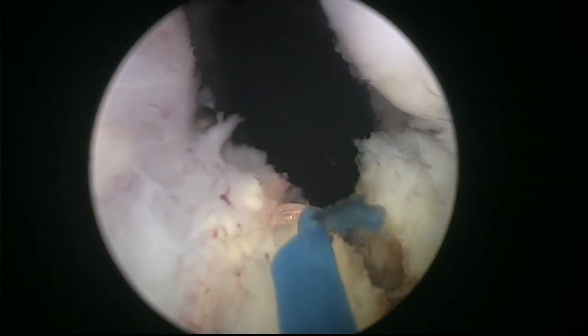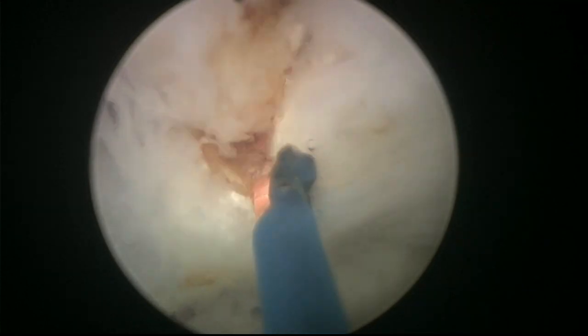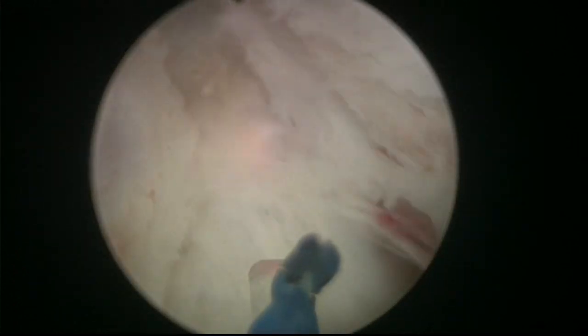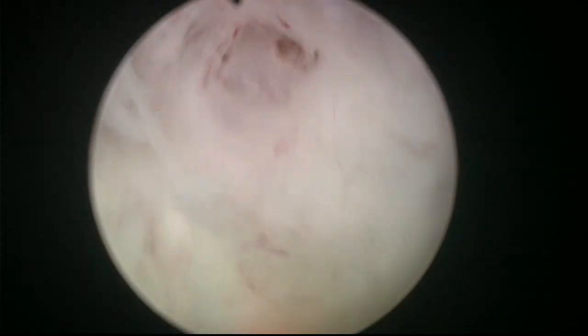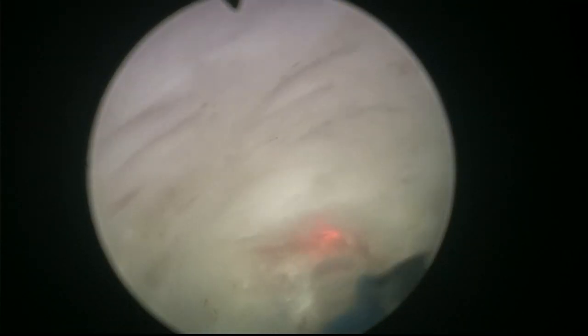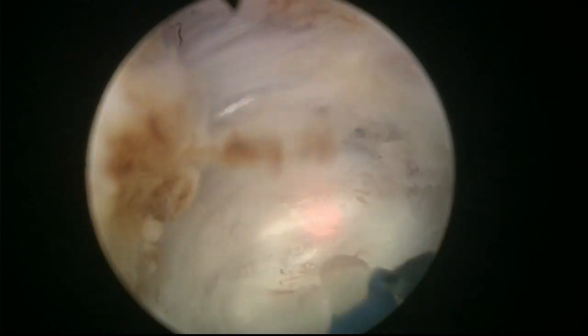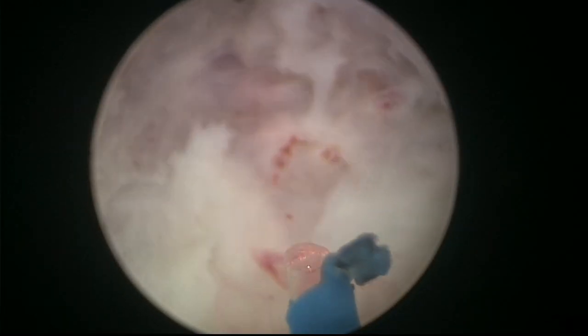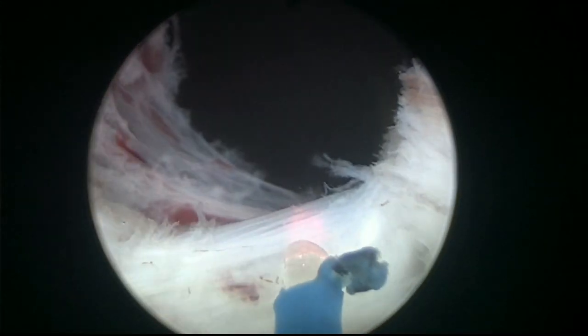So we keep on our incision. This is the original bladder neck incision. I can come a little bit further down, further up, and this way we can get to a depth that looks like the capsule. If needed, you can do a little bit of mechanical dissection by connecting with the capsule and pushing up to find the proper plane. So this incision is more or less completed. I wouldn't go very deep at the beginning, because we can correct the depth as we go. Again, this is the bladder neck, and I'm going to cut towards the midline.